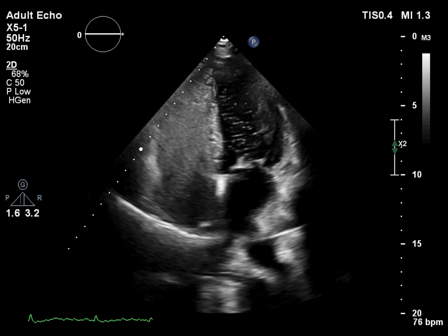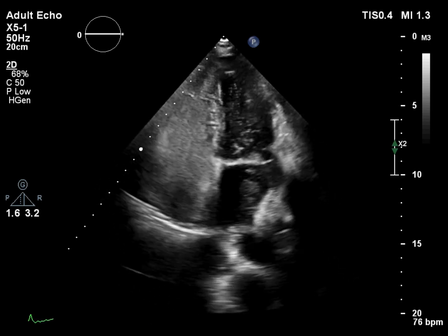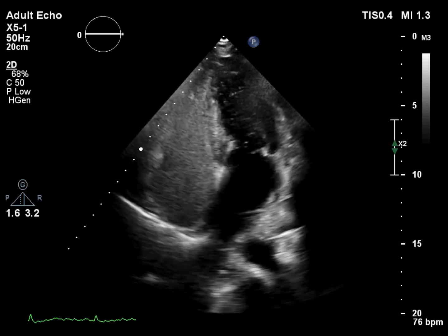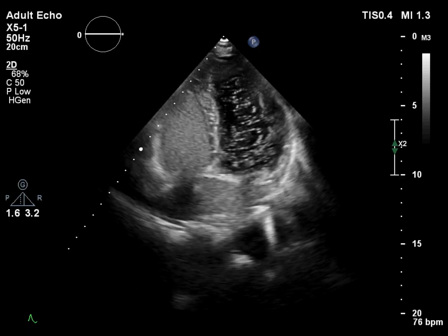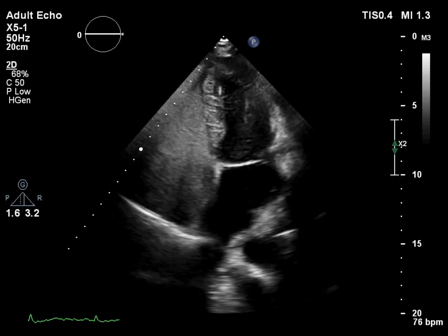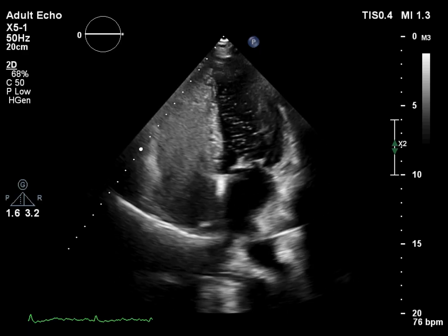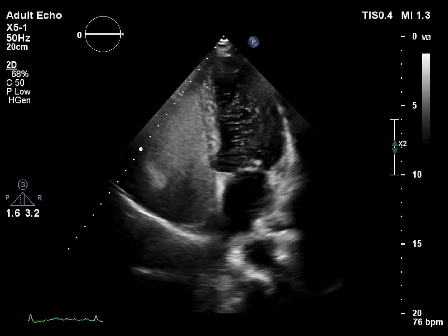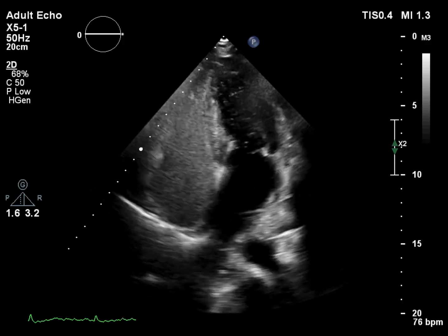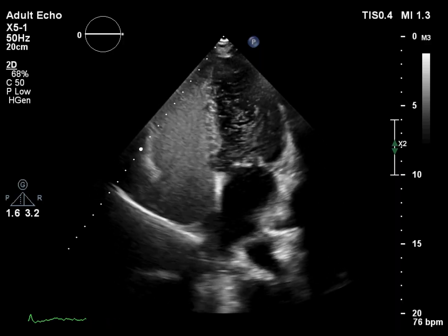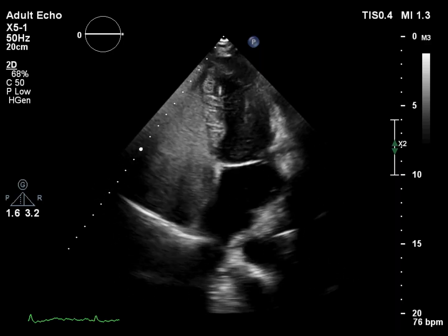This echocardiogram shows a young woman with right ventricular enlargement. The contrast study demonstrated a significant amount of contrast bubbles passing from the right heart to the left heart.